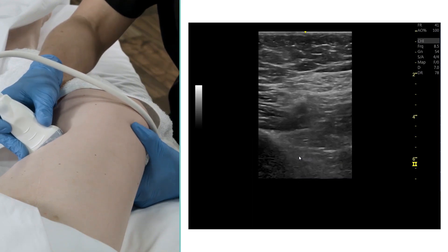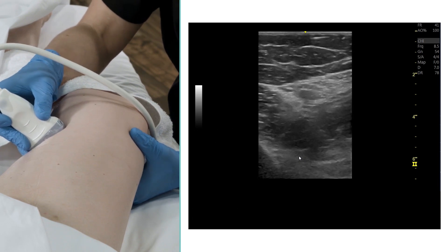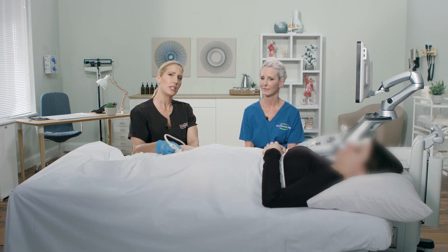As you can see, my vein wall is compressing. Julie, it looks like you're actually pinching with your free hand. Is that true? I like that — pinching.